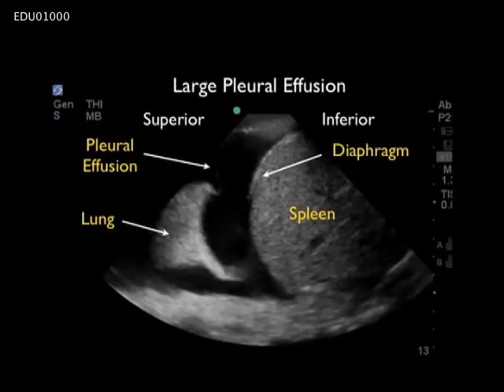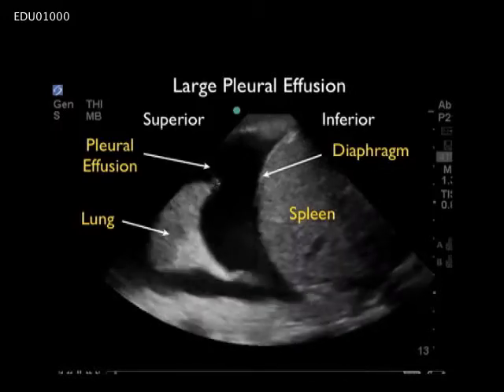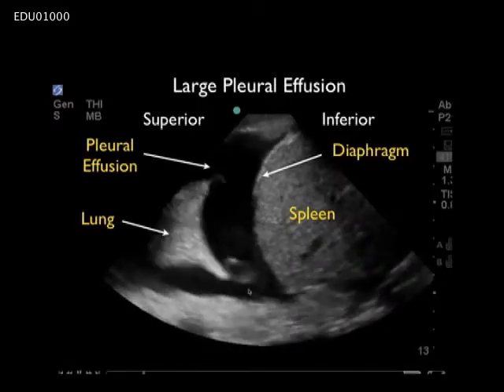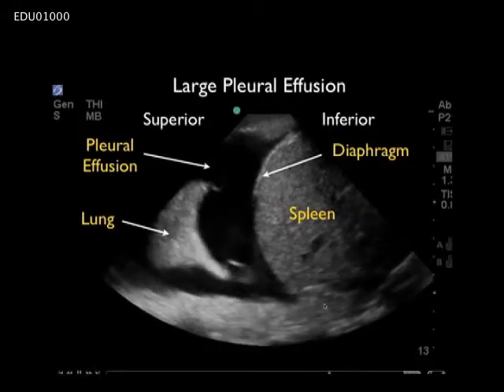By angling the ultrasound probe above the right upper quadrant and left upper quadrant views, we can actually look above the diaphragm to look for the presence of positive free fluid within the thoracic cavities. Here we have a positive examination from the left upper quadrant view, the small arrow indicating the presence of free fluid within the left thoracic cavity.